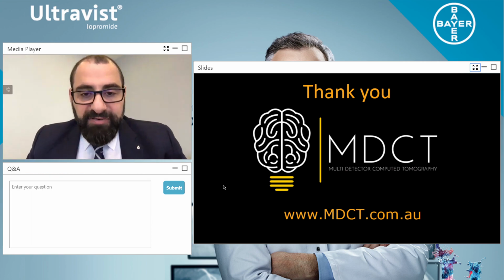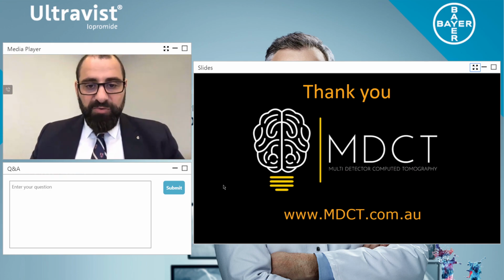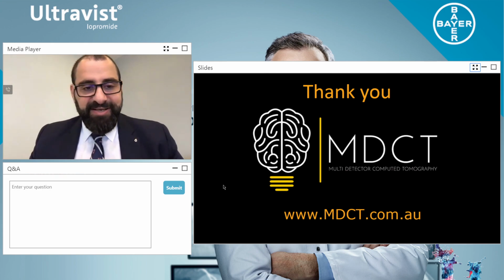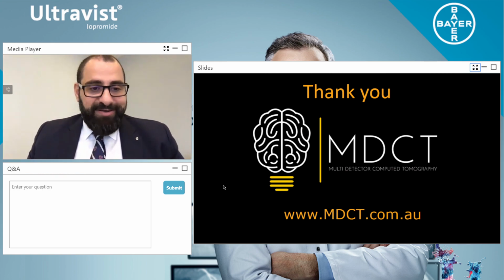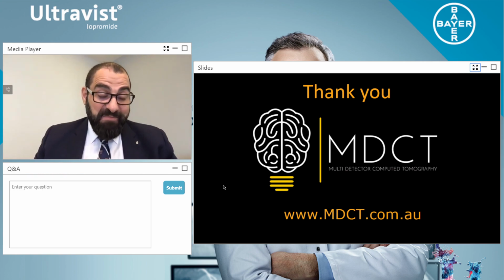I have a question from Gwen Huang. With liver CT, is it always better to use injectors or hand injections? Wow, amazing question. Again, we go back to how do we provide consistent, good quality imaging every time? The only way to do this is by using a mechanical injector.